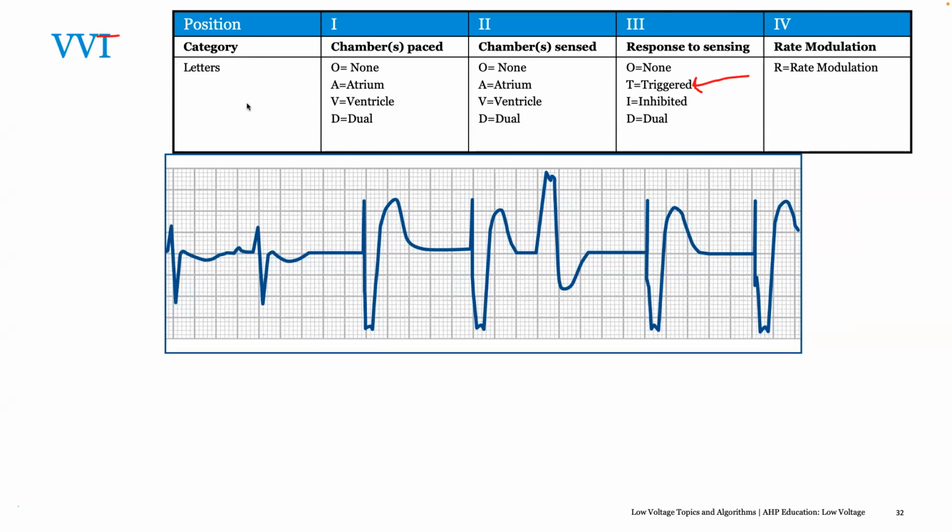Yes, those are great points, and I think, Elvis, you mentioned VVT. Jared, this V-sense response is essentially like a VVT mode, correct? Exactly. And as we discussed, I agree with you. Some people like to feel good because it pads the numbers, but whether or not it's effective, who knows? You probably have some degree of fusion, so you could argue it's helping. But whether it's worth the battery offset or anything like that.